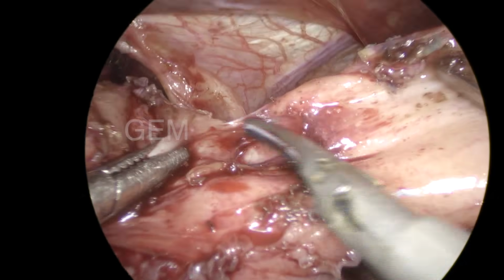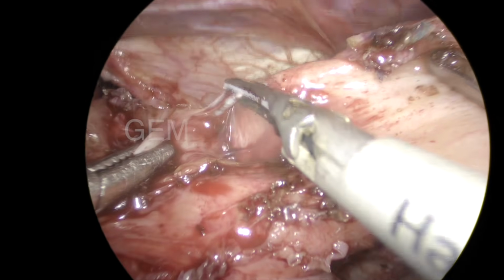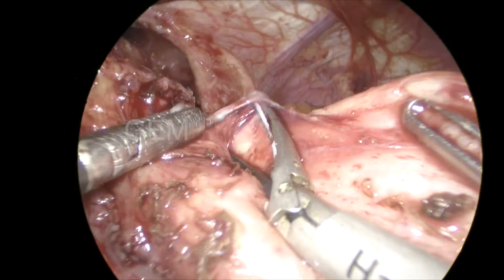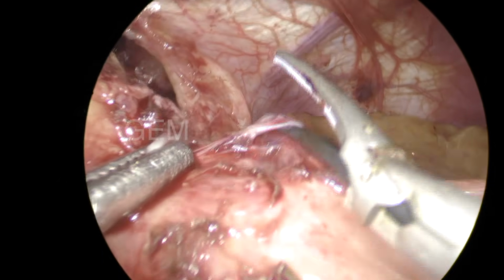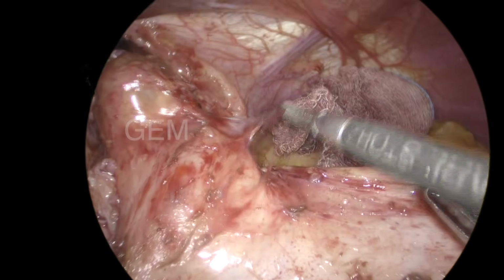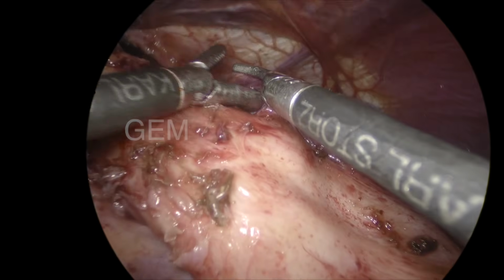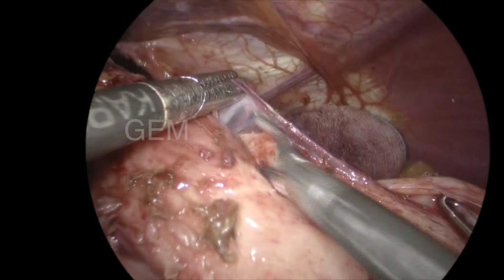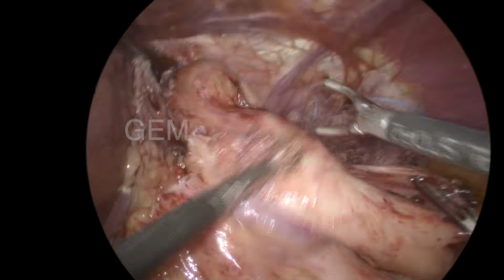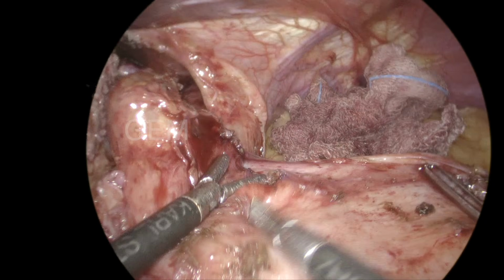You can see still some suture is there. That suture also I am going to divide. So many sutures are there, but that does not solve the problem. That means it is not the blame of the suture, it is the blame of the technique. Even if your technique is not good, you apply so many sutures, this type of complication can happen. So it should be a perfect suture at the perfect site.